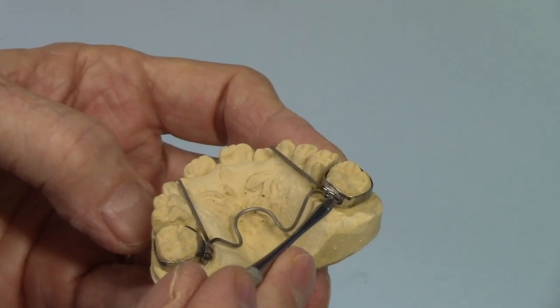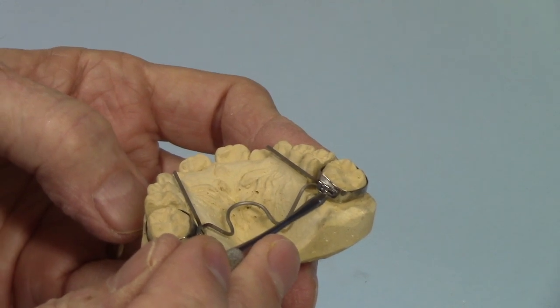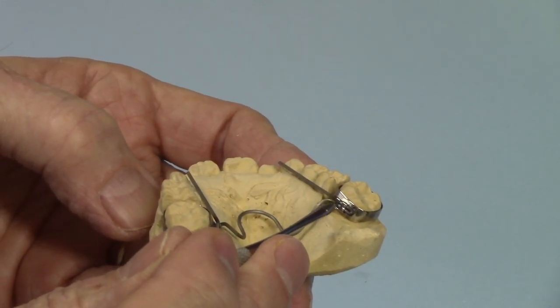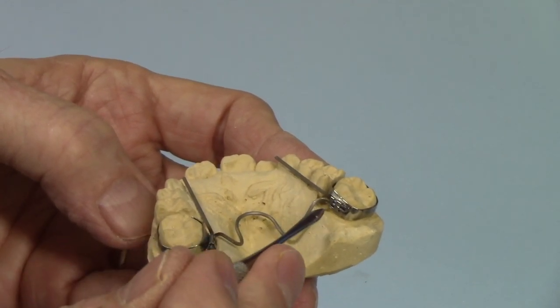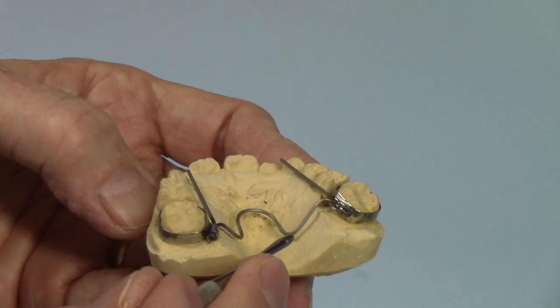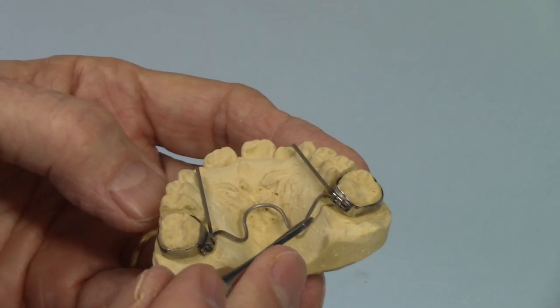Since titanium cannot be soldered or spot welded to the lingual of the bands, what I did was I crimped the wire and put it into a lingual sheath. If you're going to have this as a fixed removable appliance, you just remove the appliance and spot weld the lingual sheath to the lingual of the bands, then insert the appliance and you'll be pretty much ready to go.